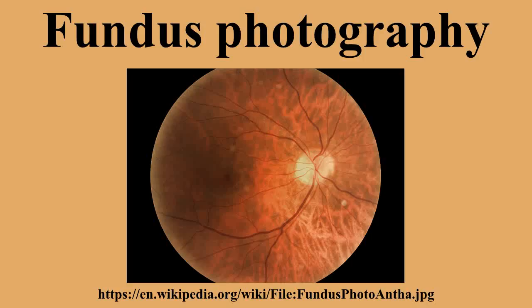Three other names played a prominent role in early fundus photography. According to some historical accounts, Elmer Starr and Lucien Howe may have been first to photograph the human retina. Lucien Howe is a well-known name in ophthalmology, and together with his assistant Elmer Starr, they collaborated on the fundus photography project in 1886 to 88. Howe described the results as the first recognizable fundus photograph, apparently a nod to Jackman and Webster being the first to publish a fundus photograph. Based on the written accounts, Howe and Starr's image was more recognizable as a fundus.